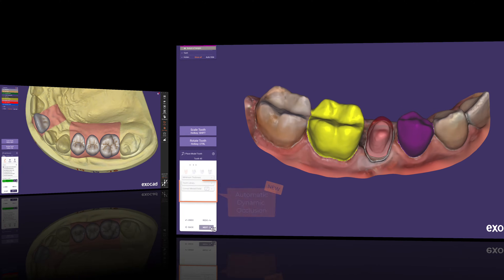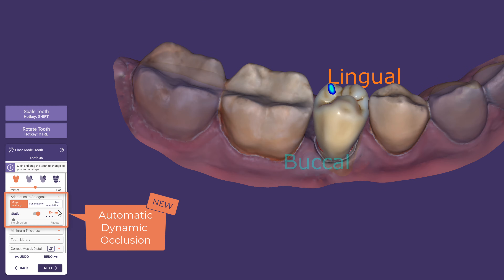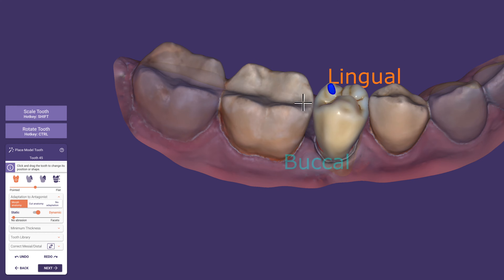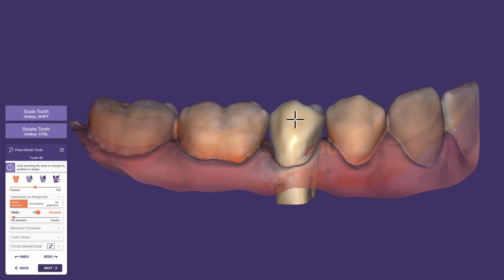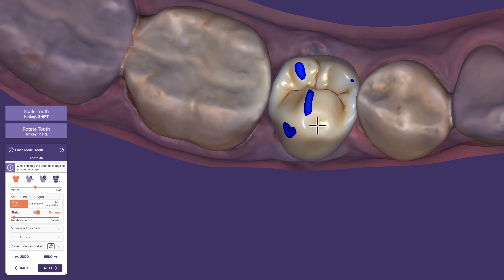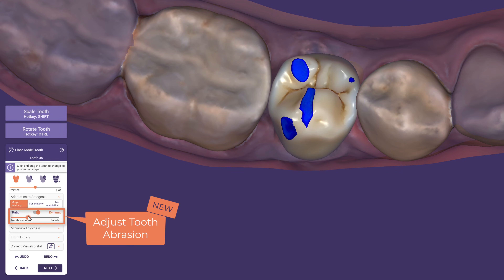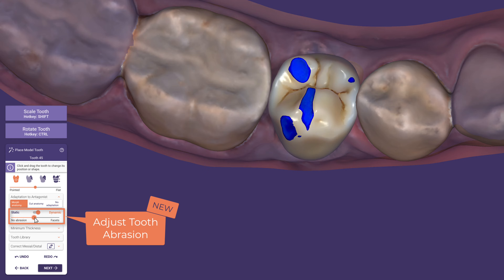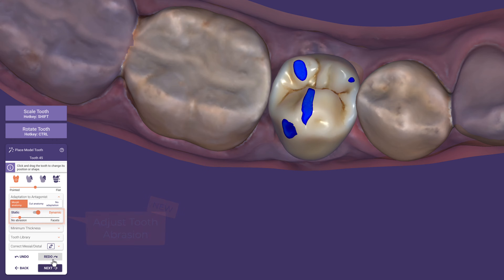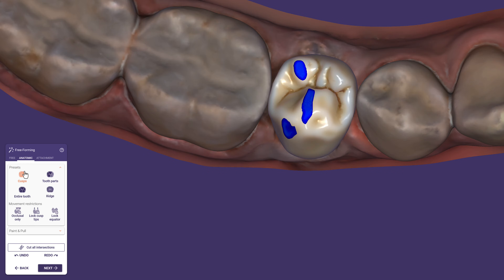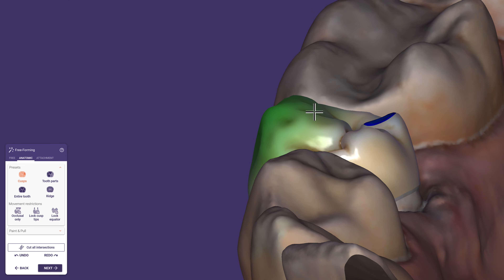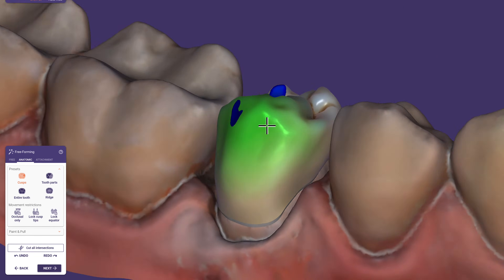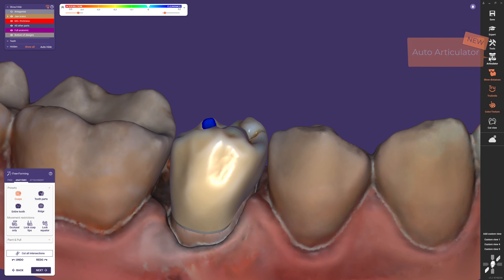With the new auto-articulator feature, your workflow is optimized once more to save time. After it is calculated, the automatic dynamic occlusion is available. A slider enables the adjustment of library tooth position to better match the adjacent teeth and to mimic natural abrasion in real time. The positioning of the scan inside the virtual articulator and the articulator movements are performed automatically in the background for you.